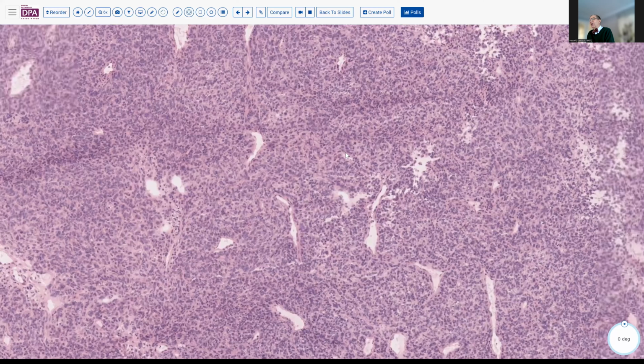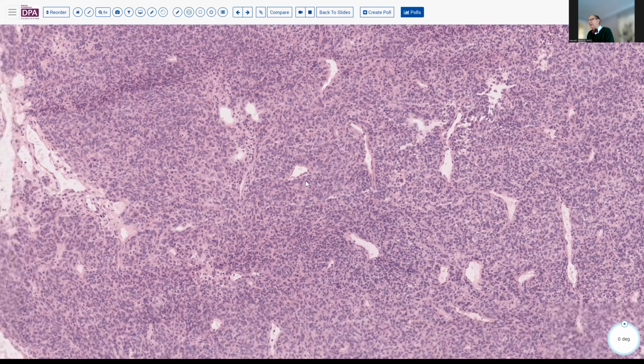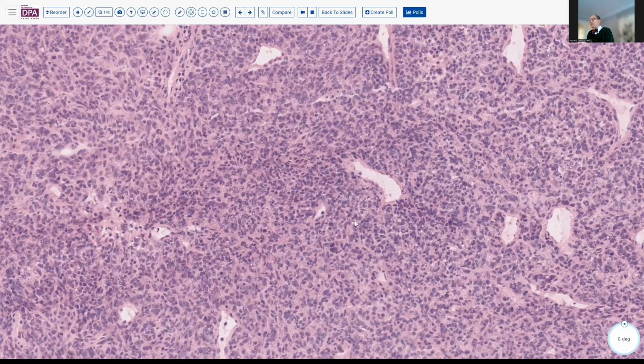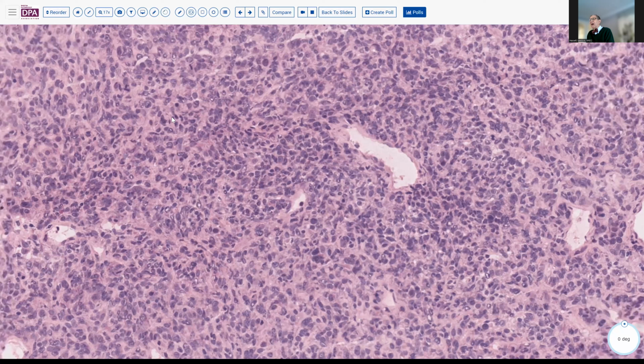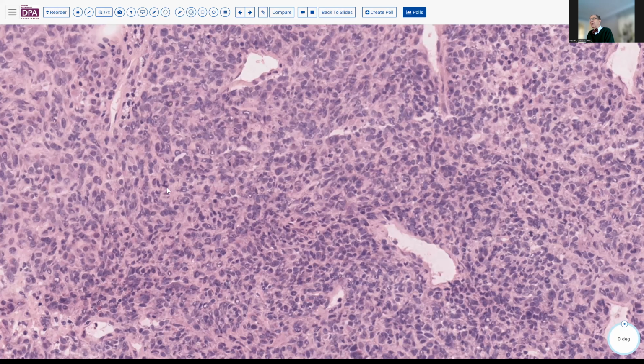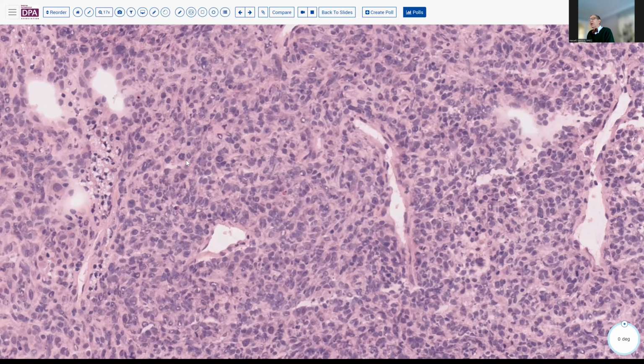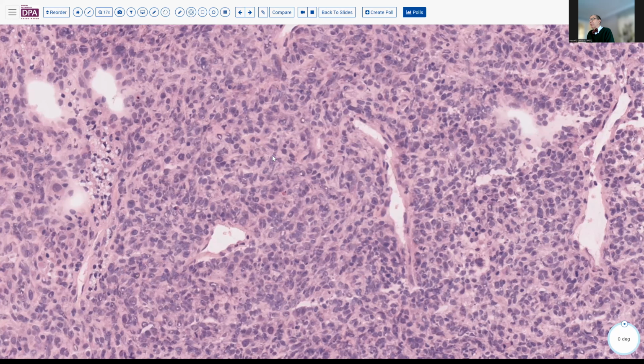And this was a patient who had a known primary tumor, and therefore detecting a recurrence in a distant location away from the primary tumor was sufficient to establish it as malignant. However, you'll note here that the cytology is not overwhelmingly anaplastic or particularly high grade. There are a few mitoses here, as you note. But that's why this is a lesion that's considered a low-grade malignancy rather than a benign tumor.